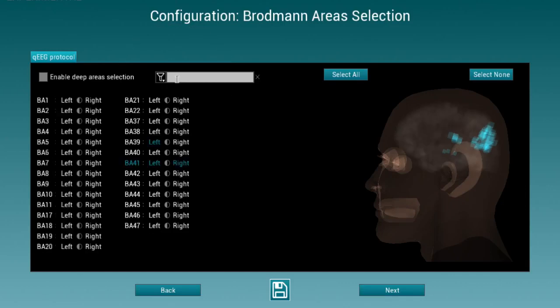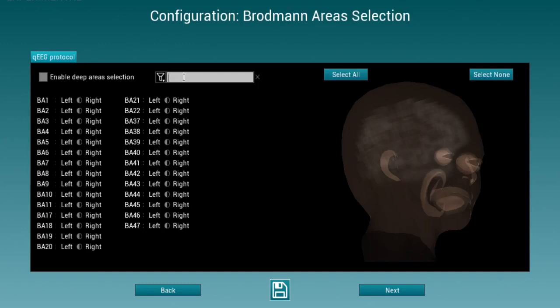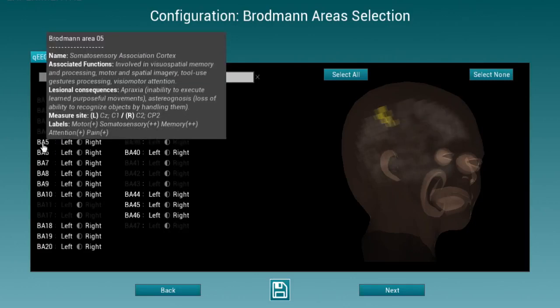Once you've done so, it is time to select the Brodmann areas you'd like to reinforce. You can either select these areas yourself if you know what they're related to — they highlight in yellow on the right-hand side when the mouse is over them. If you don't know much about Brodmann areas, it is possible to search them by keyword. For instance, if you want to uptrain functions associated with memory, just type 'memory' and we will highlight Brodmann areas related to it. You will see a brief description of each Brodmann area when you put the mouse over it.